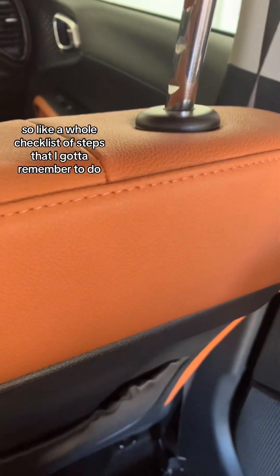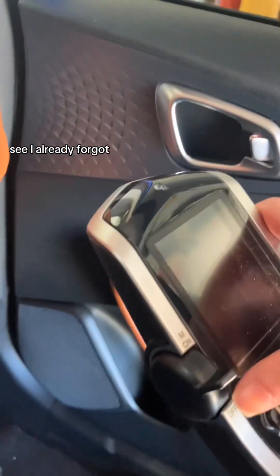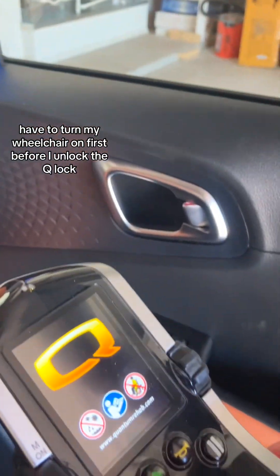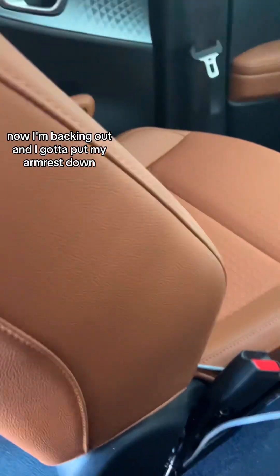I just transferred back into the wheelchair from the driver's seat. It's like a whole checklist of steps I gotta remember — I feel like a pilot doing a checklist. I already forgot: I have to turn my wheelchair on first before I unlock the Q-lock. This little red button over here. Okay, unlocking the Q-lock now, backing out, and I gotta put my armrest down.